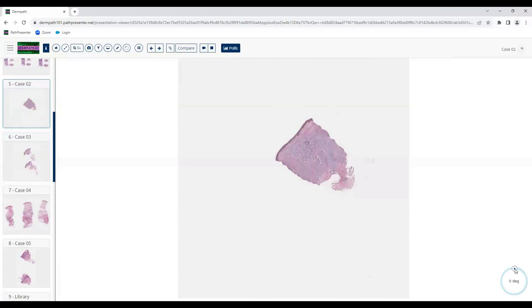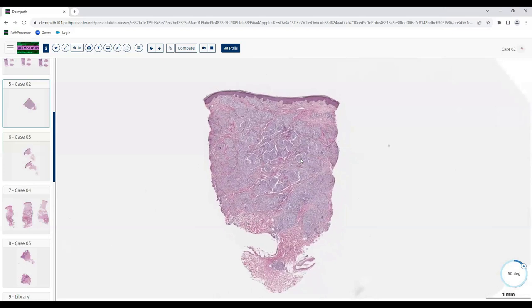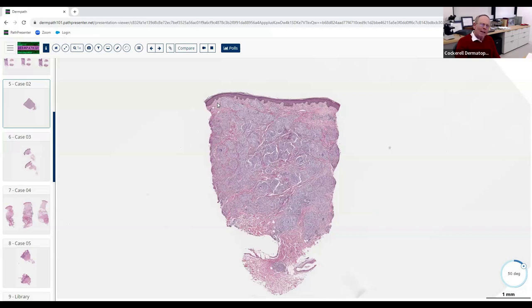All right — next case. It's a punch biopsy. From scanning, it looks like there are these pale cells that kind of cluster together. We want to resist the reflex to go to too high magnification too fast — learn as much as you can at low magnification. Everything said so far is correct. Is this likely inflammatory or neoplastic? Inflammatory — good. What's the pattern of inflammation? It seems granulomatous.